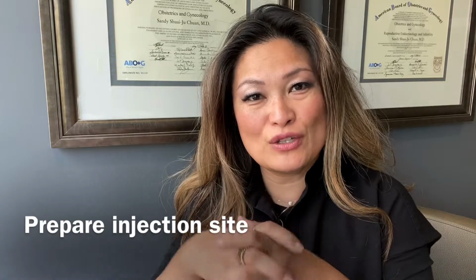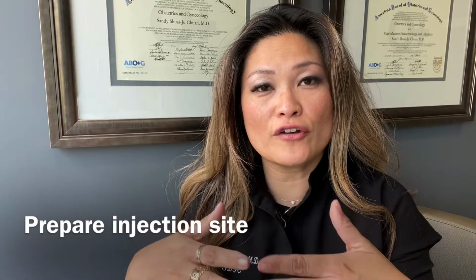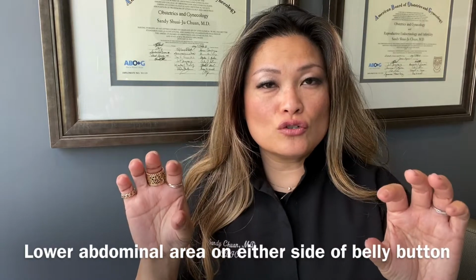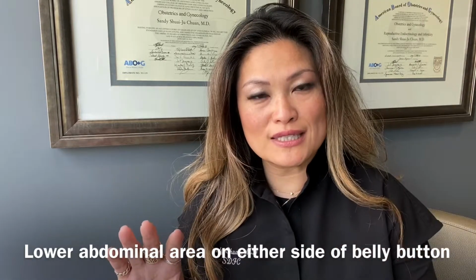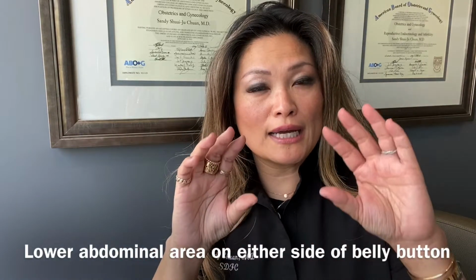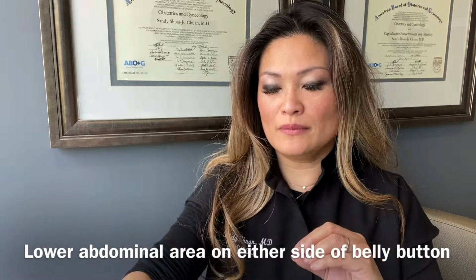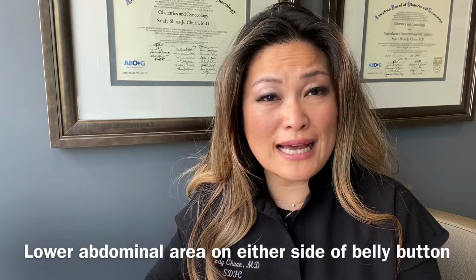So the next thing that you want to do is prepare your injection site. First it's figuring out, where am I going to inject myself? I always tell everybody to find the area right next to your belly button. That's where most of us have some extra flesh. Even if you're really skinny, you're going to have a little area that you can pinch. So I always tell people to pinch that skin next to their abdomen, next to their belly button. That's the best area. It doesn't have to be the same exact spot every night.